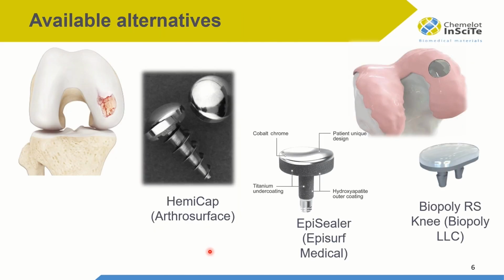There are already some available implants in the market. These are Hemicap, Episealer, and Biopoly. The first two of these implants are fully metal, while the Biopoly implant has a metallic stem with a polymeric top layer.